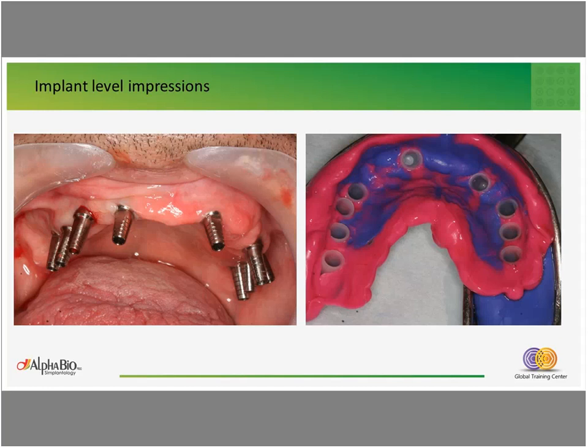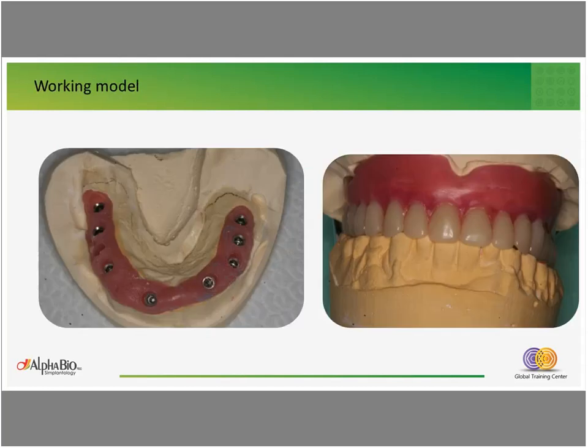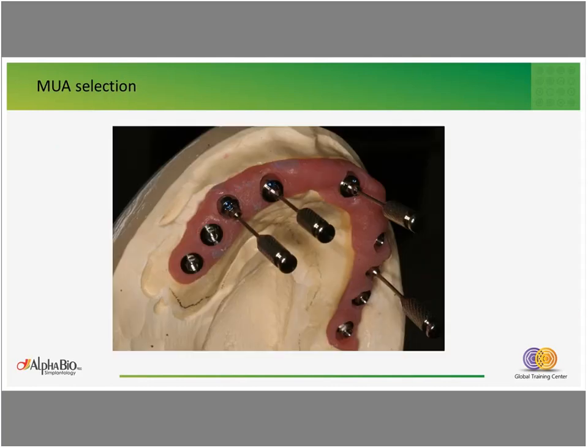In some implants that have a good position, we use the straight multi-unit abutment. In other implants, we have some angulation. So in order to have all the access points lingually, we need to use the angulated multi-unit abutments. The angulated multi-unit abutments make it easy to make a screw-retained restoration without losing any of the aesthetic result.